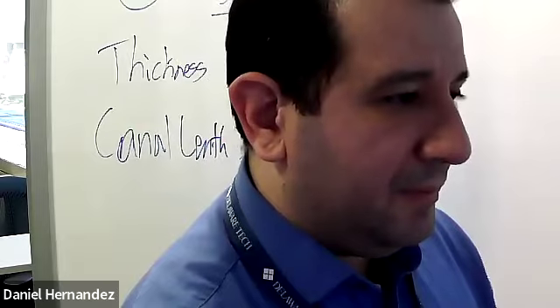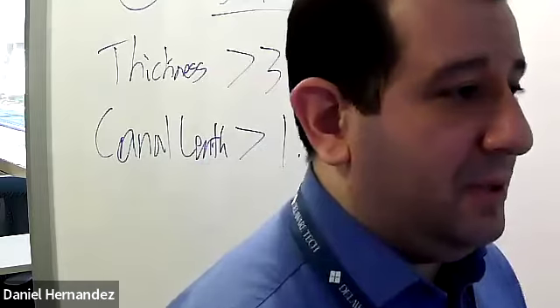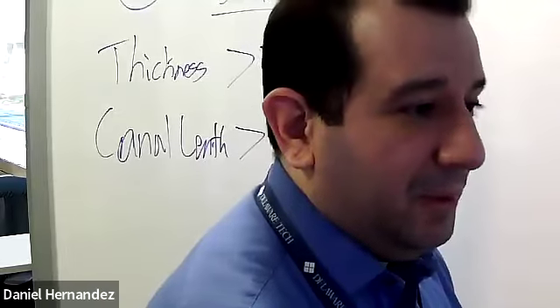You could see that mushroom top or that triangle for the duodenum. So there is the duodenum and the pyloric channel itself, and then that's the actual sphincter and the muscle that grew and became thickened in hypertrophy. Transverse views allow for measurement of the pylorus overall and the wall thickening. Sometimes it's referred to as a bagel or donut appearance of a hypertrophied pyloric muscle.